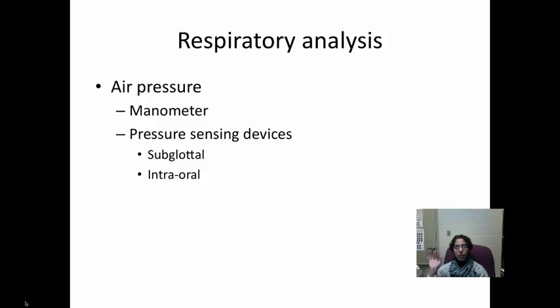So all of these tasks, and what they did was, as part of the study, I had to be completely numb. So we had a scope that went in through the nose, a nasoflexoendoscopy. Nasoflexoendoscopy means a catheter goes through your nose and comes out behind your nose and hangs right above the velum, so you can get a direct look at your vocal folds. So I had to be numb in my nose.